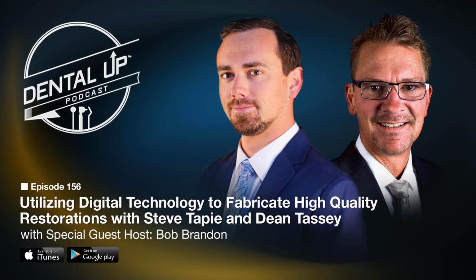And I know we're going to touch on this later, with our angulated screw channel abutments that we have going now with the different companies. Nobel has their ASC. We have our Keating custom abutment with the angulated screw channel. Atlantis has two of their platforms for the angulated, and I'm sure they're going to come out with more. This is going to bring the access hole to 20-25 degrees so we can get it in a desirable location and make it screw retained, where before it was coming out the facial and we would just have to make it cement retained. So screw retained is becoming more prevalent, and it's going to become a lot more popular in the future. It's retrievable, and it's a great restoration.